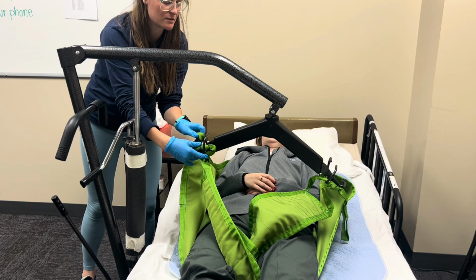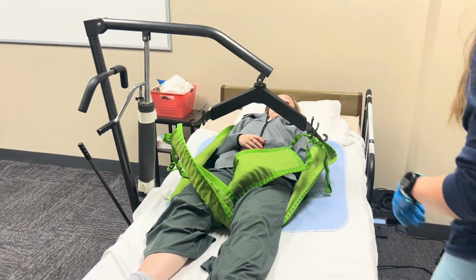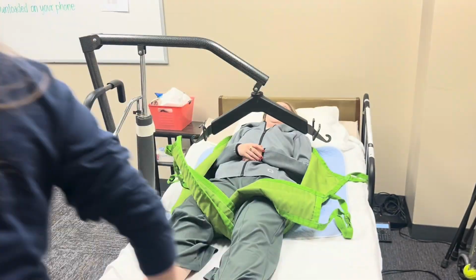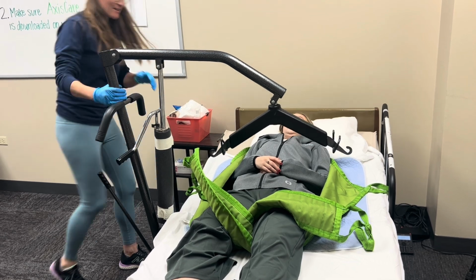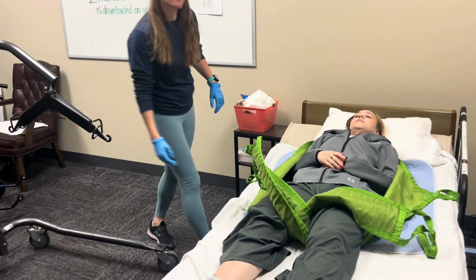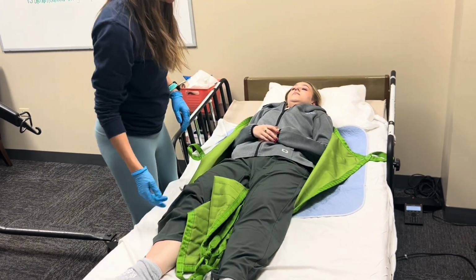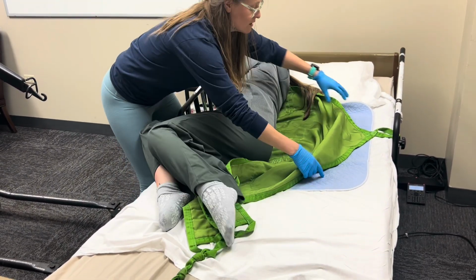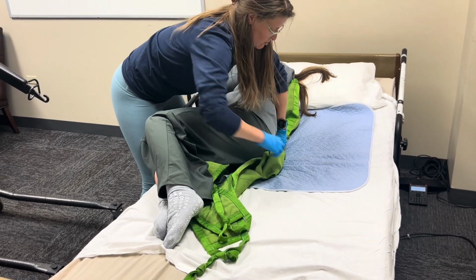So then I take this out. This out. So pull your out of the way. Just kidding. Take the brakes off. We're going to put up the bed rail because we are rolling. Miss Michaela, can you bend both your knees? Perfect. Can you reach over here to roll? Great. Same way I put it in is the same way that I take it out. There. I'm going to roll it up in a little bunch.